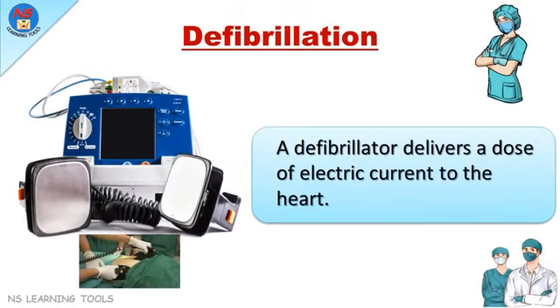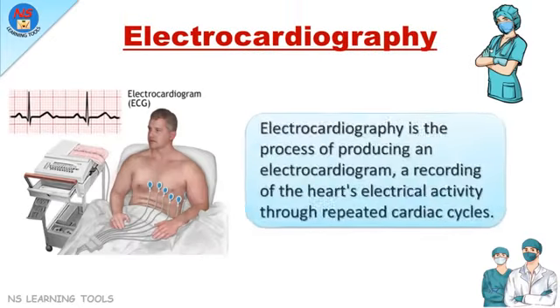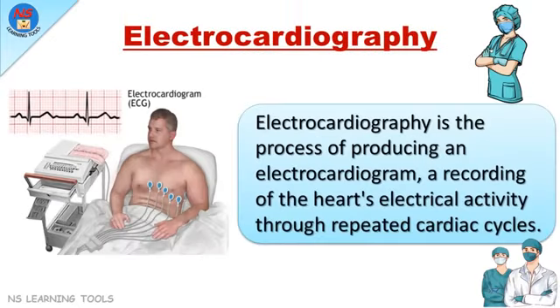Defibrillation. A defibrillator delivers a dose of electric current to the heart. Electrocardiography. Electrocardiography is the process of producing an electrocardiogram, a recording of the heart's electrical activity through repeated cardiac cycles.